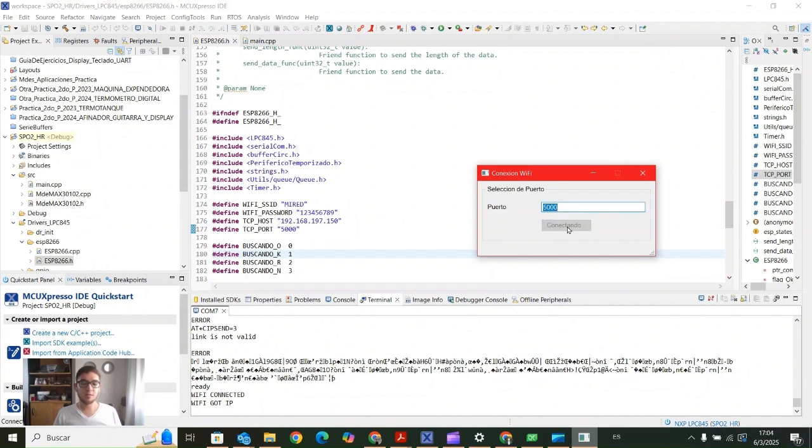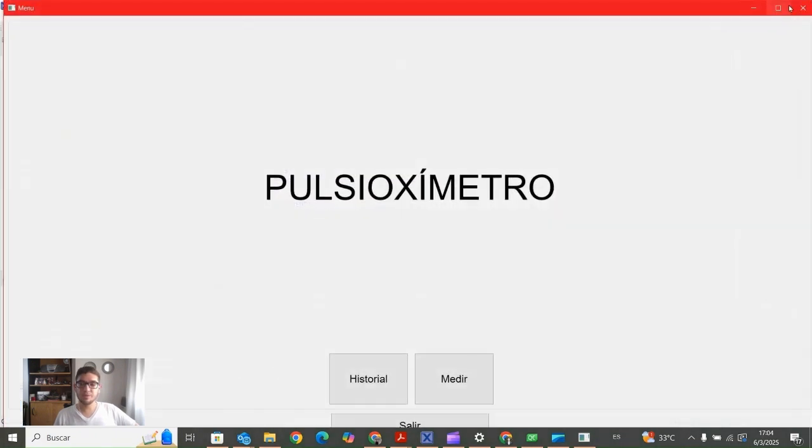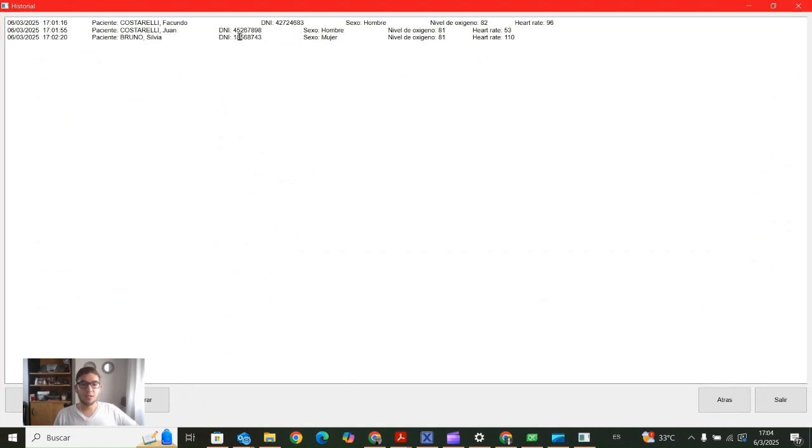We click on connect. It's taking more seconds than it is expected, so push reset button. We see in the terminal these messages when we are connecting to MIRED and the password. Now again we have the user interface, and we can click on, sorry, historial, that would be history, and we can see the data of our patients. We have some index problems maybe, but it's not so important at this moment.